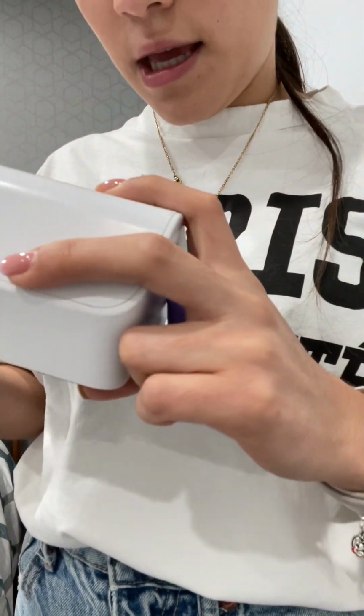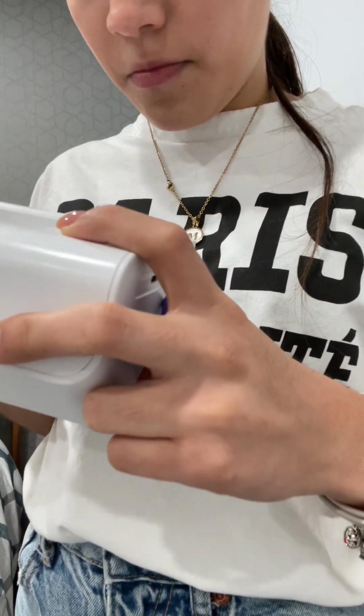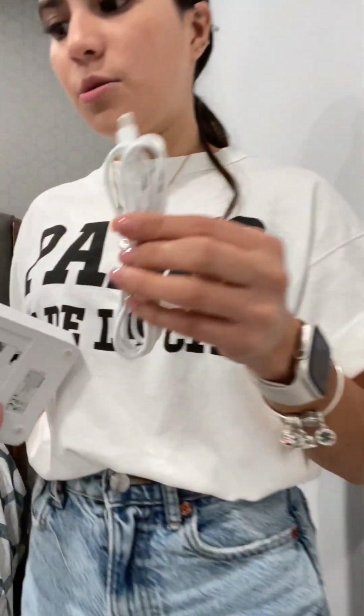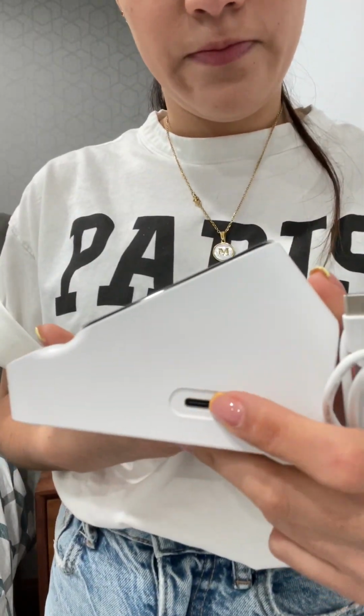Or the second one, it's just using 3 batteries. I think it's a double A battery. It says here double A battery. You just need 3 of those. Or the other one is with the power adapter that you put on here.